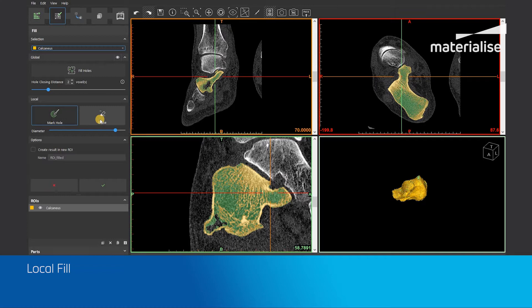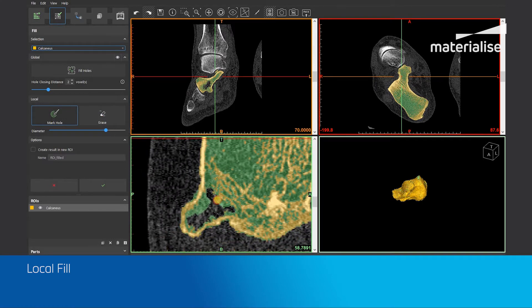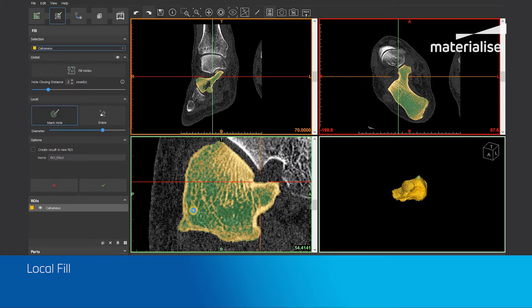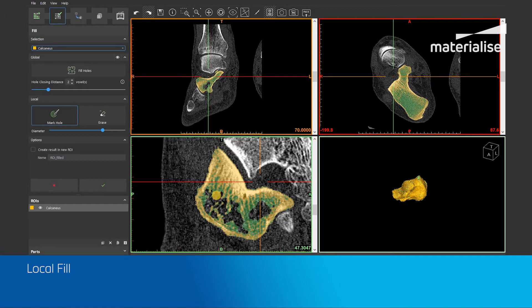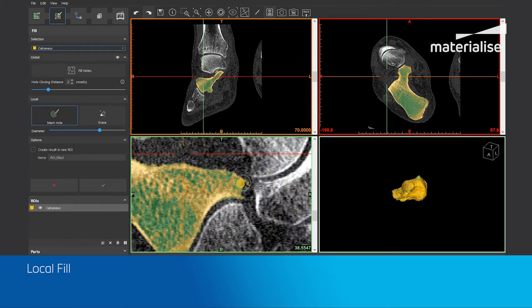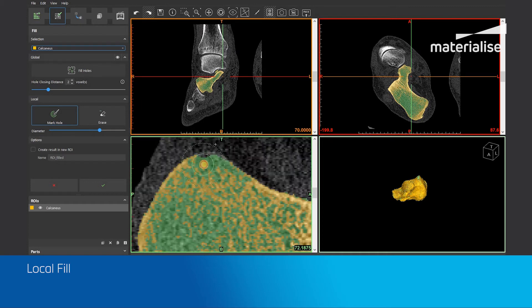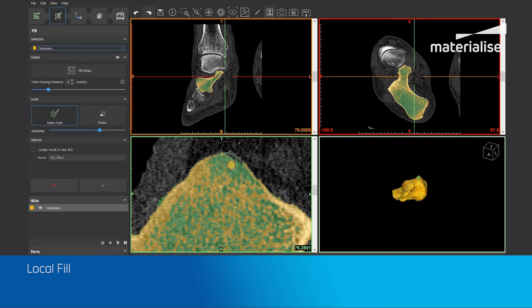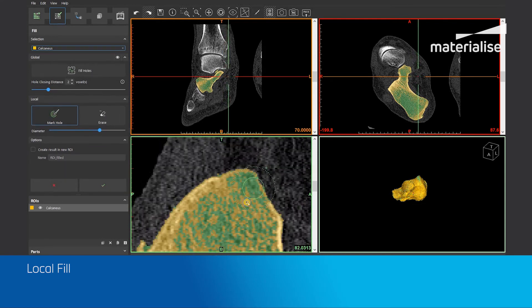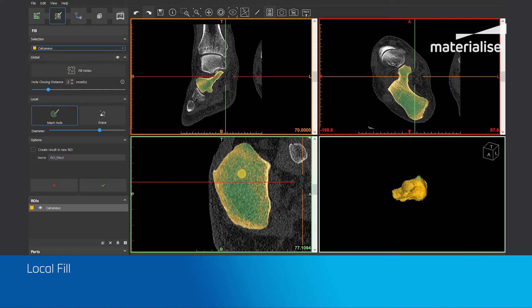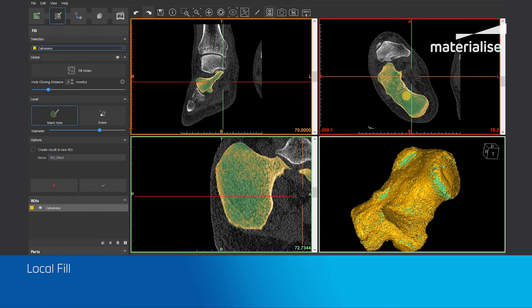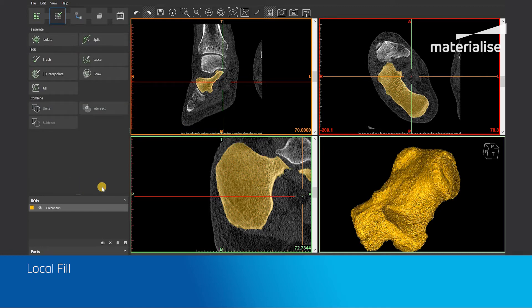I will now continue filling up the Calcaneus region of interest. After filling up everything, you can review the results in the 2D images or in the 3D view. Afterwards, click on the green tick mark to apply the operation. The filled up regions will now be added to the input region of interest and the result is a completely filled up region of interest.